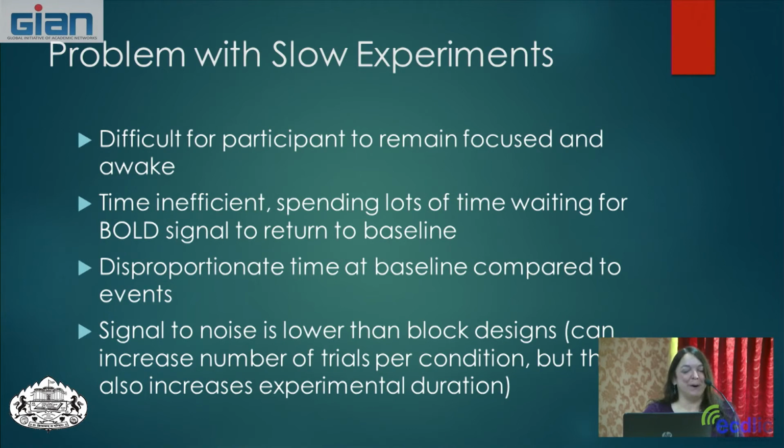These are also not very time efficient. We're spending a lot of time in these experiments waiting for the BOLD signal to return to baseline. Because of this, we may have most of our time spent in the experiment waiting for this baseline to come back down rather than actually having the person actively doing something. Also, a disadvantage of this is the signal to noise is lower than in the block design experiments.